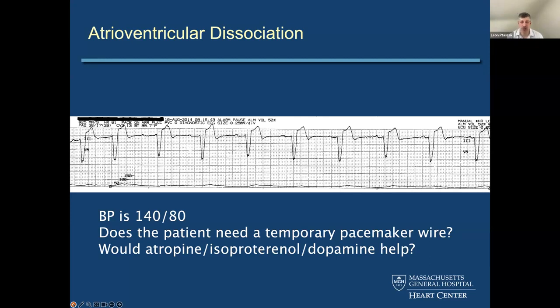It's especially important with transcutaneous systems, because they're painful for patients, to use them as little as possible, especially if you're not able to sedate them very safely. If the person's hemodynamically not all that stable and you don't want to be lowering their blood pressure any further, it may be tougher to give them medications to sedate them. So having them in backup mode with a rate lower than their native rate can be helpful. But if you've got somebody with a very low heart rate, less than 30 beats per minute, and or evidence of hemodynamic instability, then I just set the rate at 60, for a native physiologic rate.